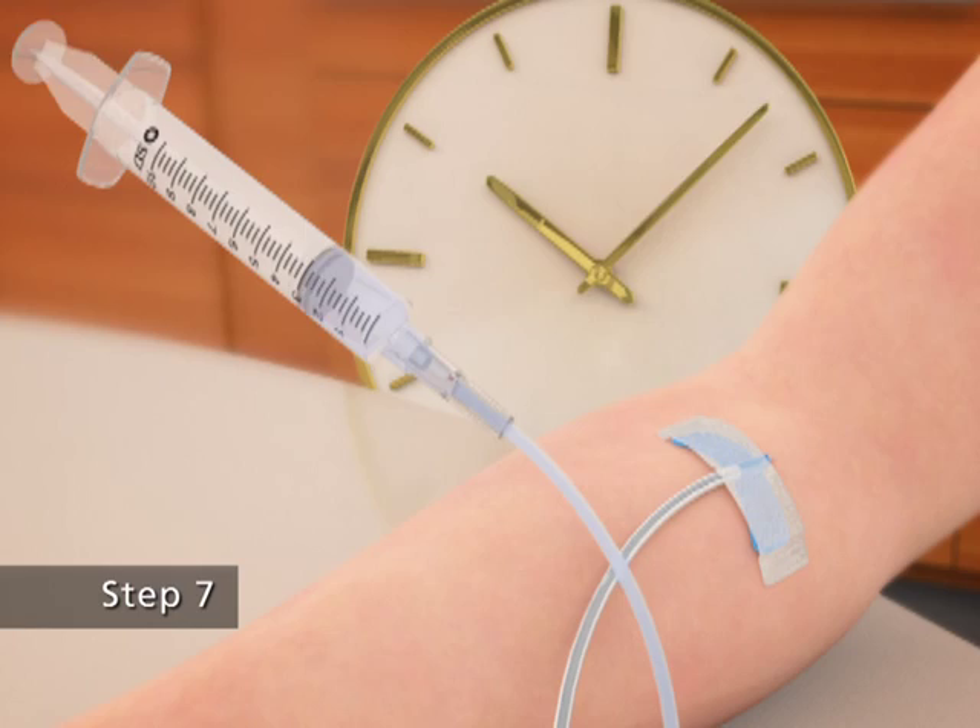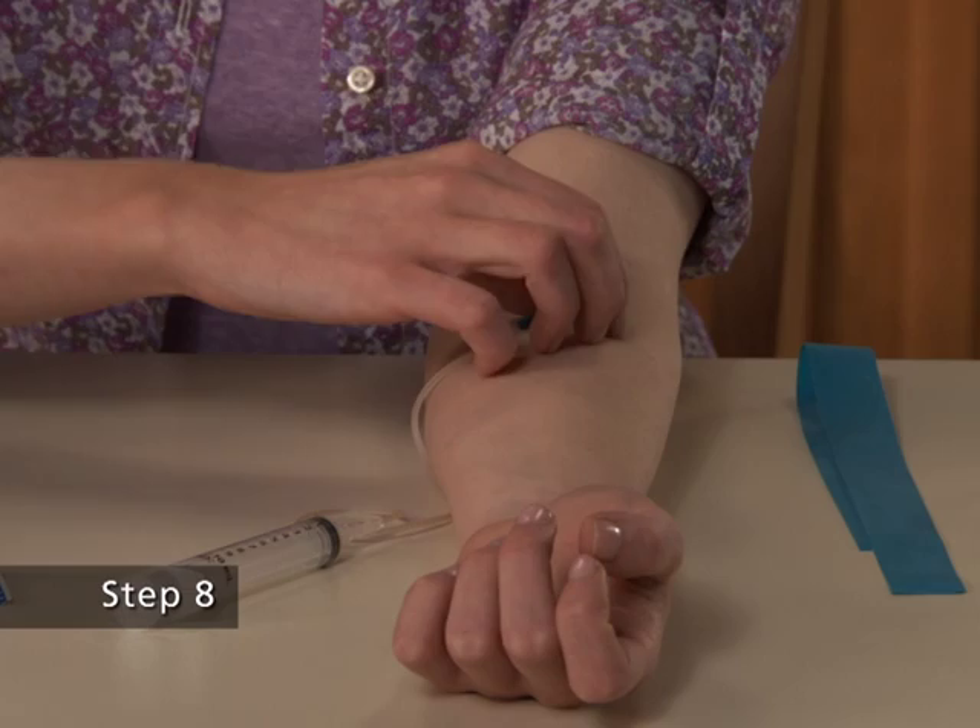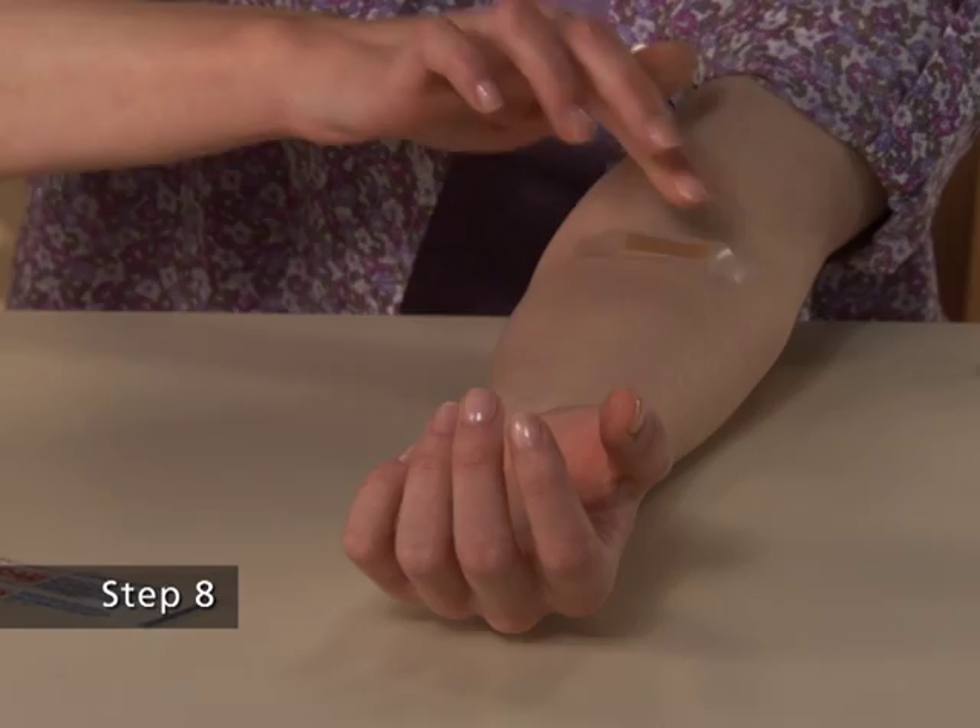Inject the dissolved Synrise slowly over 10 minutes, approximately 1 milliliter per minute. Step 8. After infusing Synrise, remove the infusion set and cover the infusion site with a bandage.